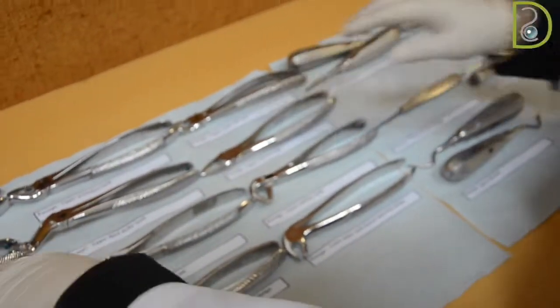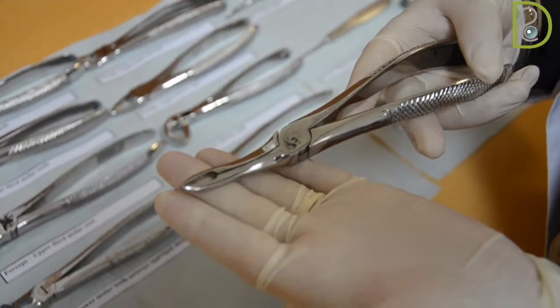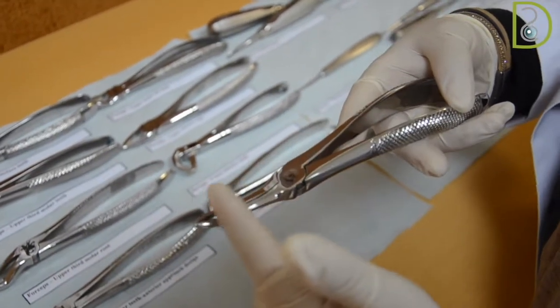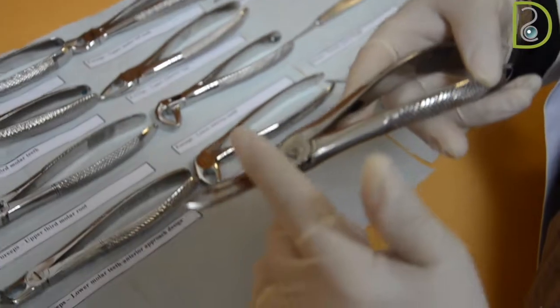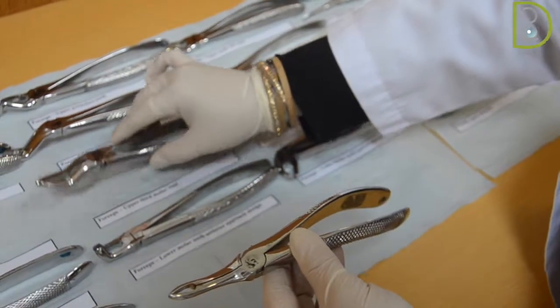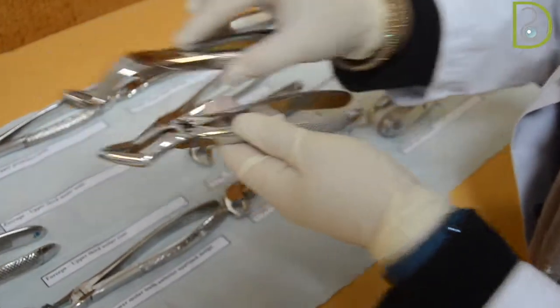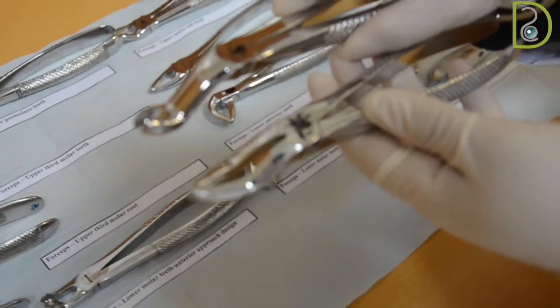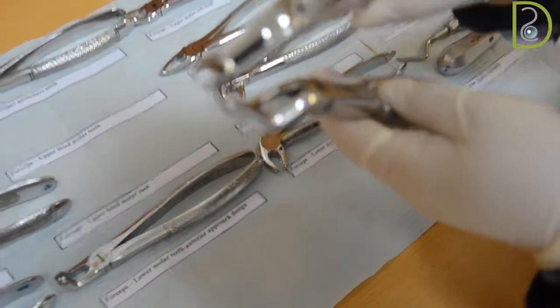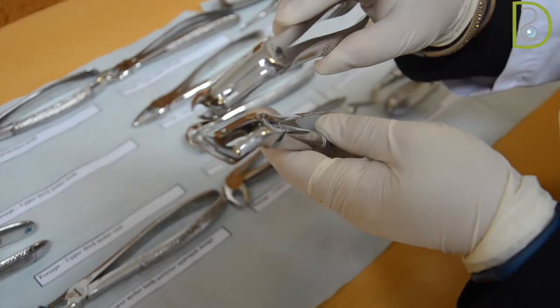Now for the upper posterior root forceps, it is a little bit angled upwards to help reach the posterior region. This curvature will help to reach the further posterior position. There is also the third molar root forceps. You will find it a little bit similar to the bayonet, with two angles, one at the joint and the other at the beaks, but it is different with its closed beaks, which are a little bit cylindrical and longer.